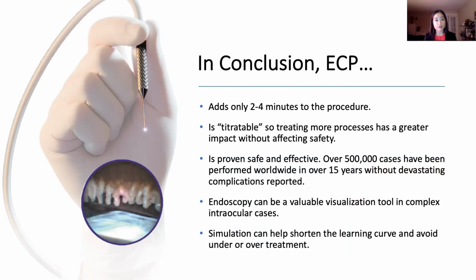And endoscopy alone can also serve as a valuable visualization tool. The simulation and a dry run before the first few cases can really help the surgeon feel comfortable and shorten the learning curve associated with its unique setup and avoid an under or over treatment that can really affect the desirable outcome.